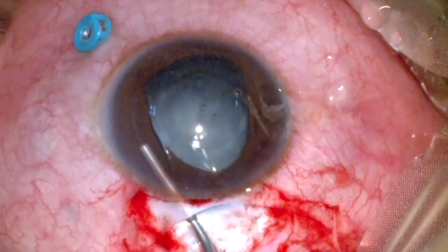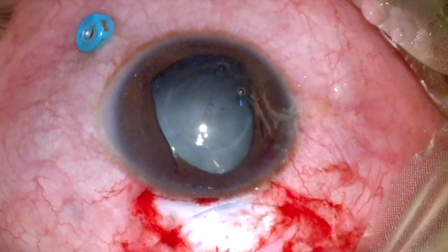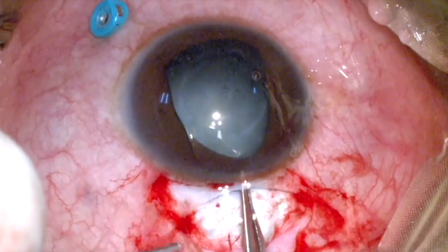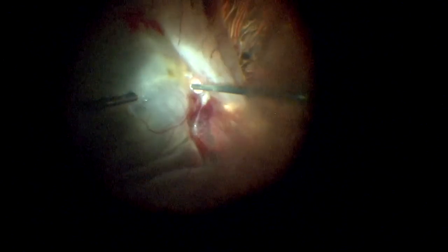And then I had planned to do the cataract surgery and not put an intraocular lens as patient was a high myope. And when I entered the eye after removing the silicone oil, to my surprise I found that the PVD had not been induced. So one can see that there were two large giant tears, one in the nasal quadrant and one in the temporal quadrant, with an area of needle perforation just above the optic disc.